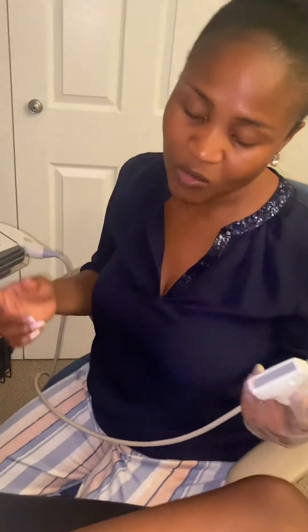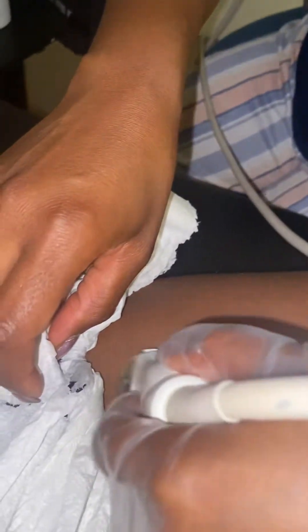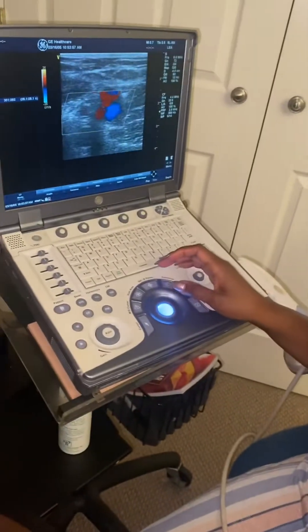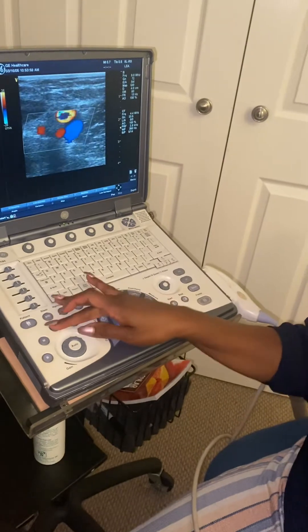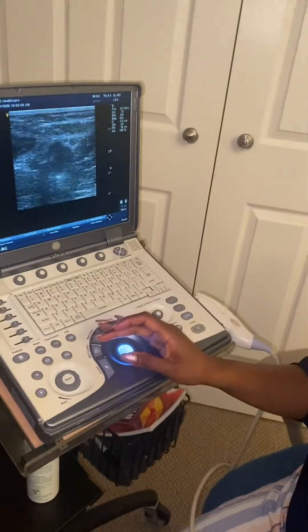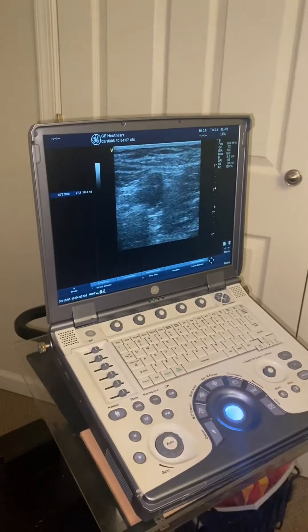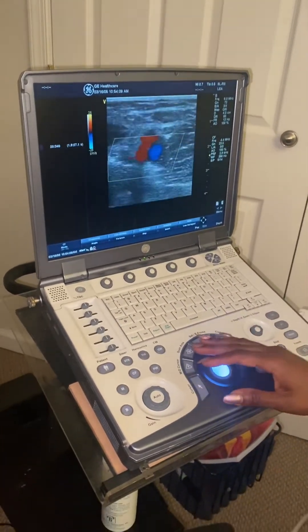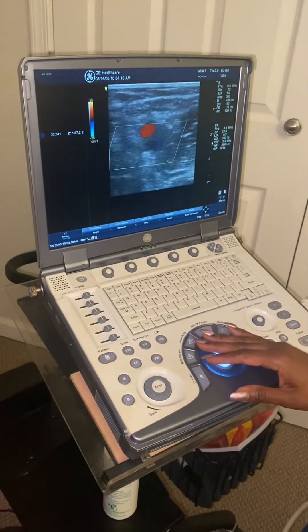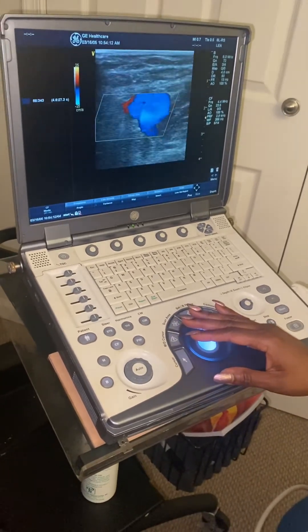I am scanning left-handed today, so please bear with me — I'll try my best to stay on the vessel; I usually scan right-handed. You can see in this image here, I'm right at the center of the thigh, and as I'm coming down, the vessel stays in view. I'm going to do color and waveforms quickly of the lower extremity arteries.